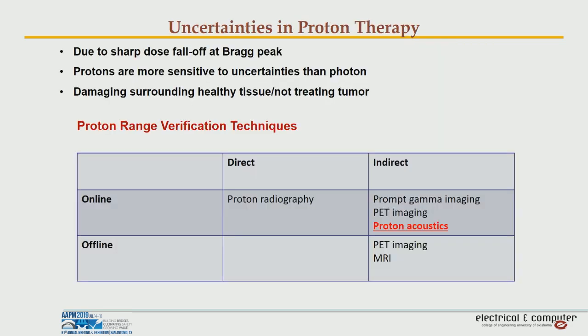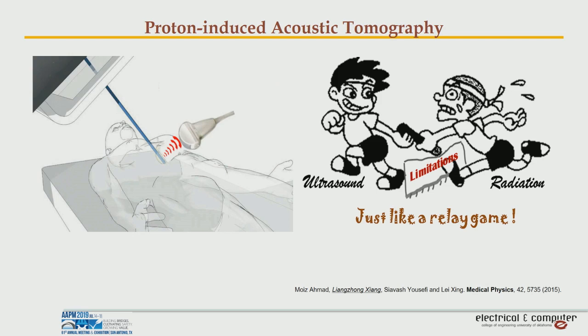There are many technologies out there that could do the same thing, but we believe this proton-generated ultrasound can do real-time monitoring, and really you can do range verification. So the idea is simple. You do the treatment. We're not going to change the treatment or interfere with it. We just put the ultrasound transducer aside and listen to the acoustic wave, and then we provide additional information on top of the original treatment.